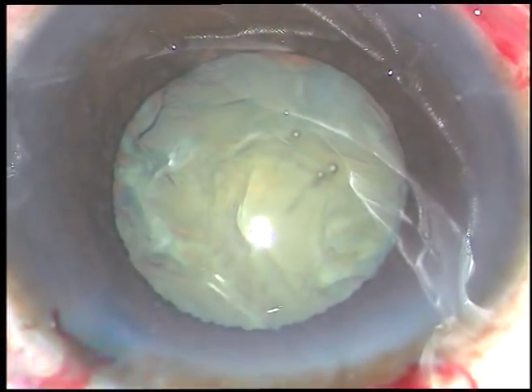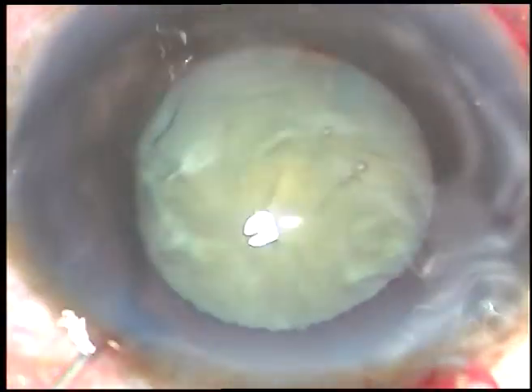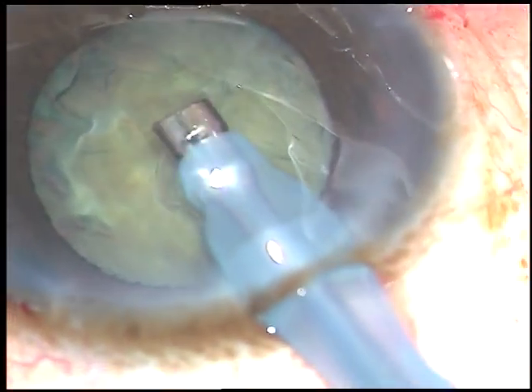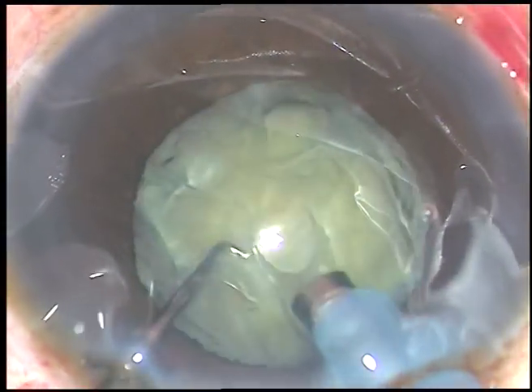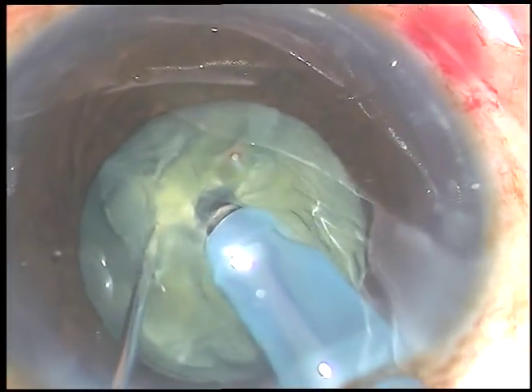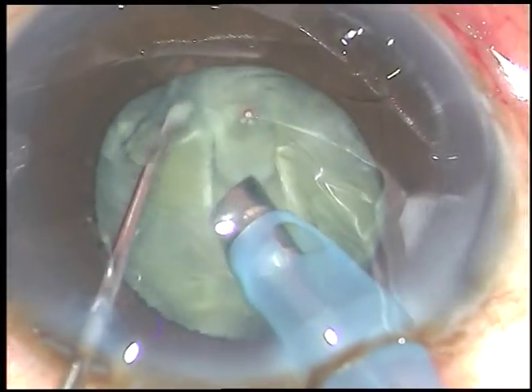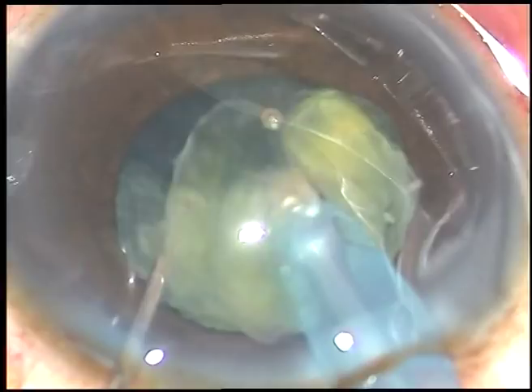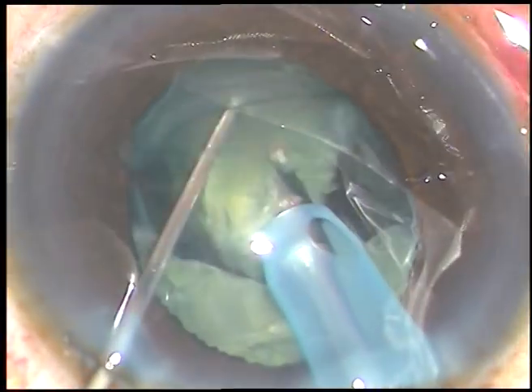Viscoelastic substance is again injected, and now is the time to introduce the tip of the phaco handpiece. The machine being used is the Oatly Cateryx Easy Phaco machine. This is direct chop — just bury the tip, hold the nucleus with vacuum, chop it, and the free nuclear fragment is emulsified and removed.